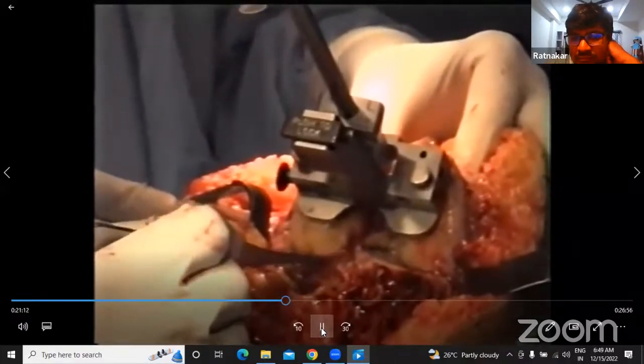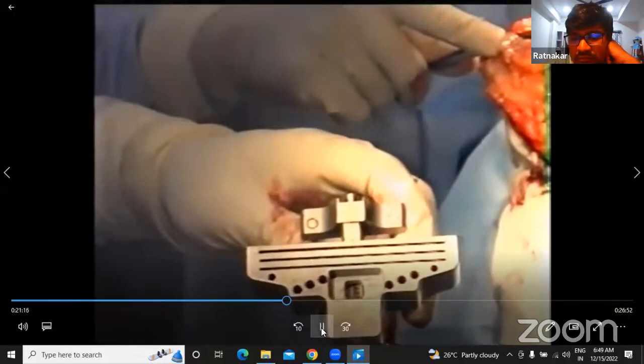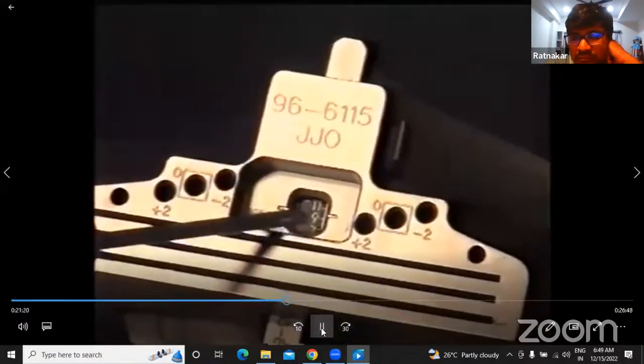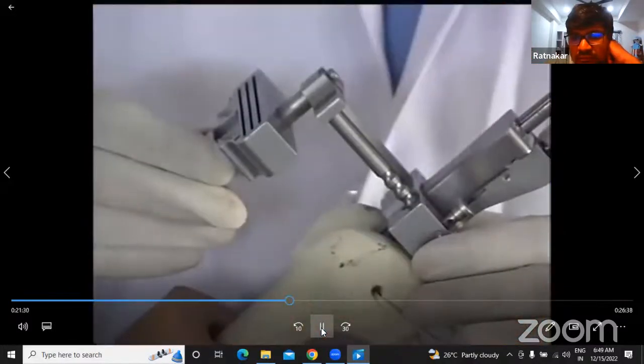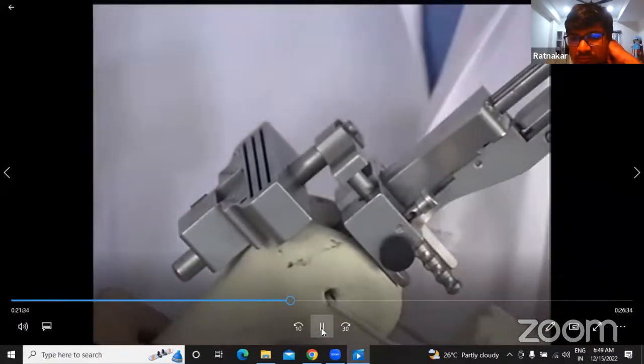These legs should be roughly parallel to the femoral condyles. This is the distal femoral cutting guide. And here, there are measurements. You have to put this at the 9. That means the distal femur will be cut by 9 millimeters, which is equivalent to the implant depth. Now I am inserting this distal femoral block like this and going for the pins.